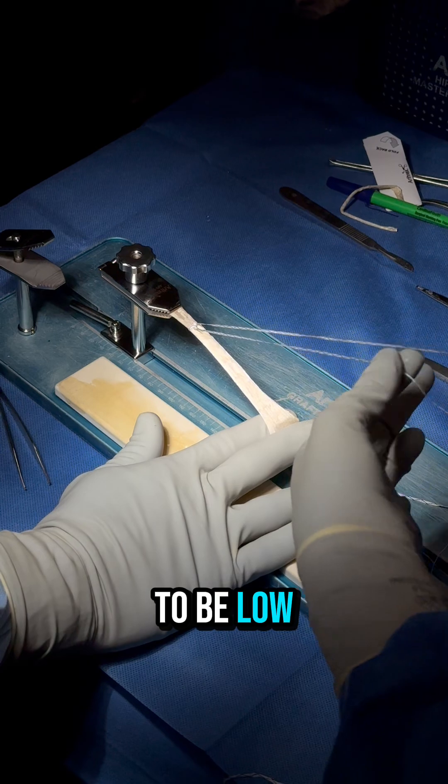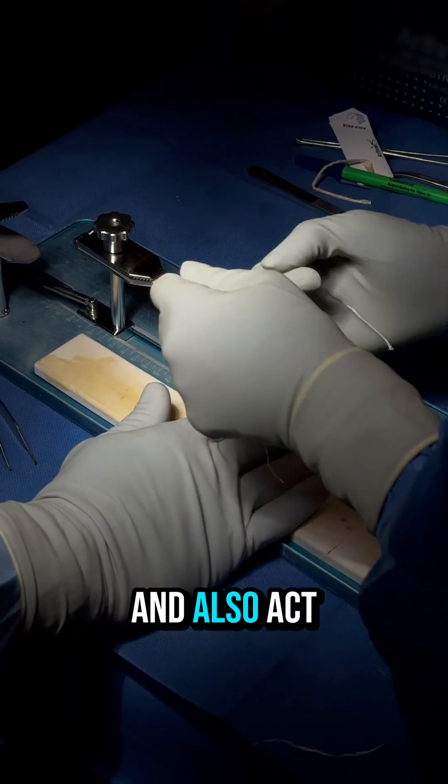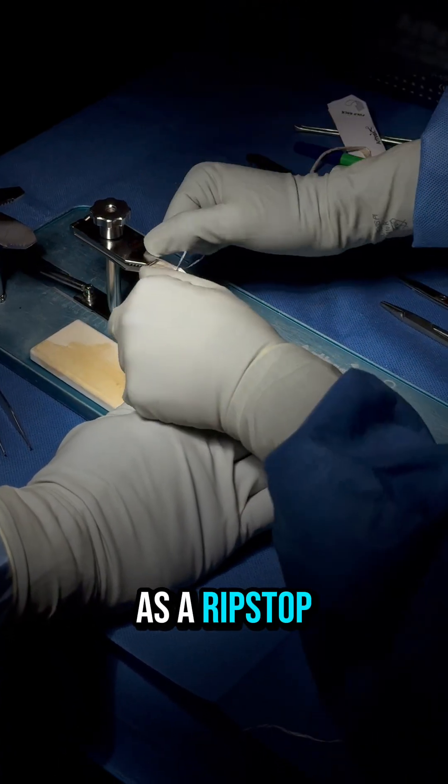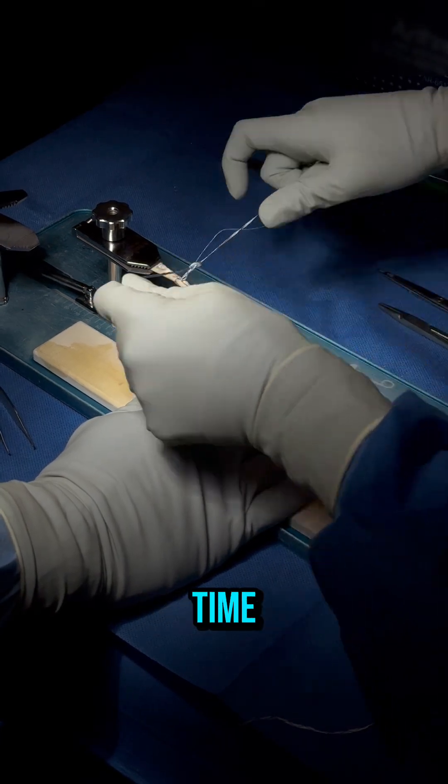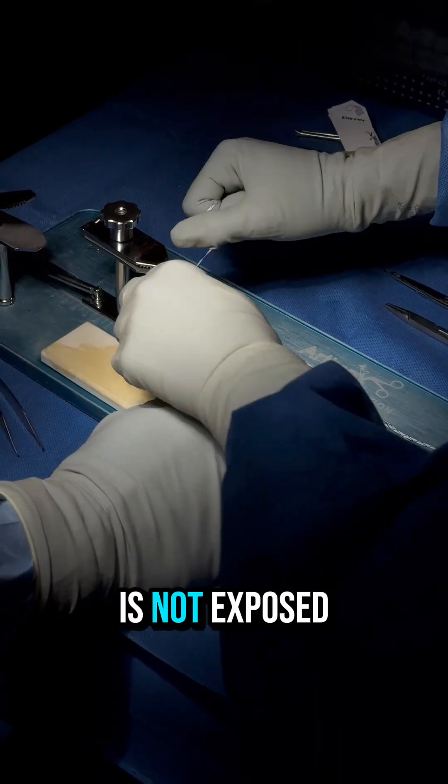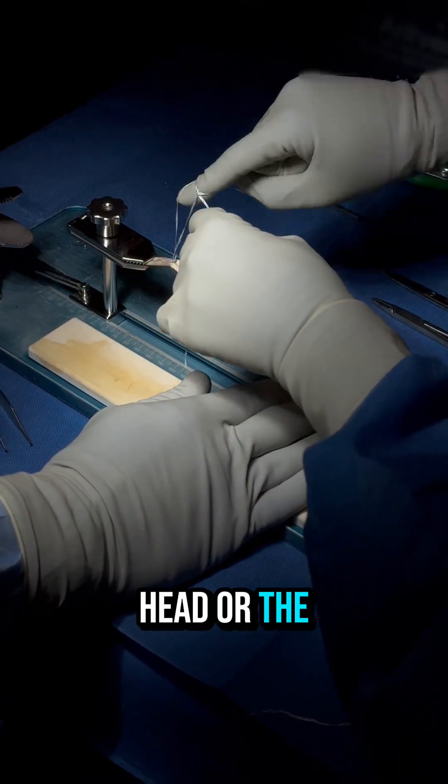This allows it to be low profile and also act as a ripstop for the suture anchor. At the same time, the suture itself is not exposed to the femoral head or the joint.